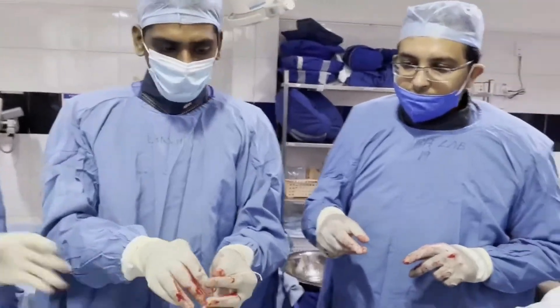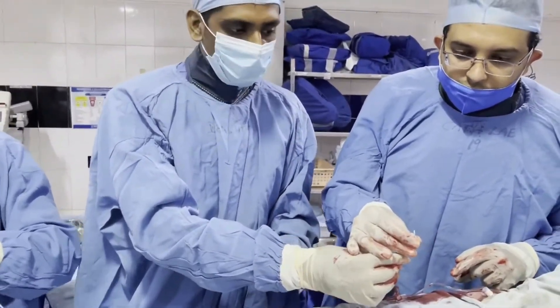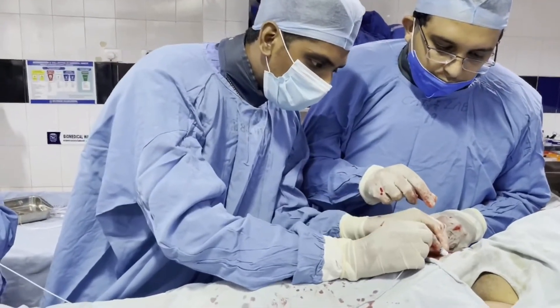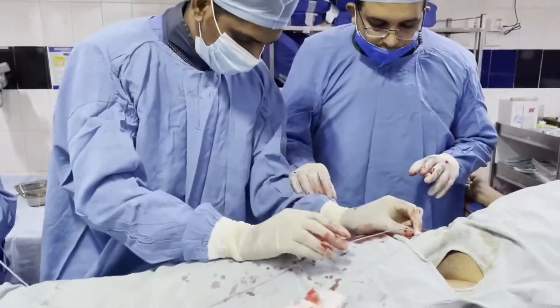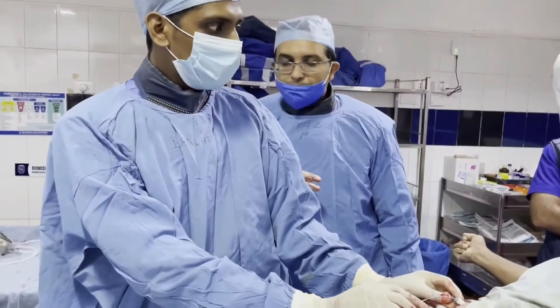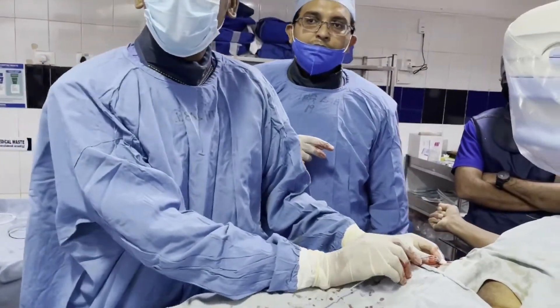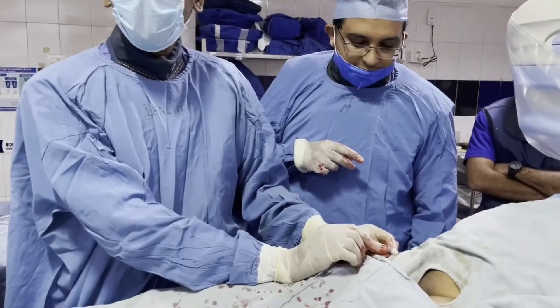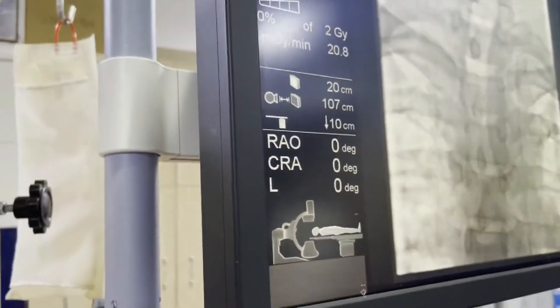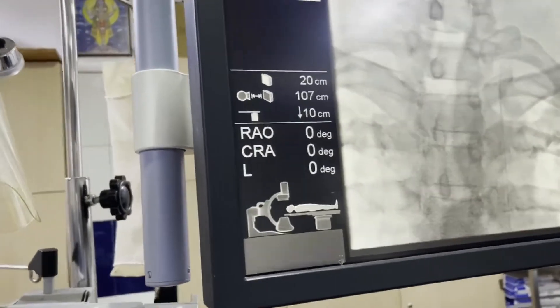Various catheters can be used — Headhunter, Glidecath, Vertebral, or even a Judkins Right catheter — based on patient age, estimated artery caliber, and expected artery response. Before inserting, make sure a wire is placed inside the catheter, as the wire should always be in front of the catheter by at least 10 centimeters. We have now inserted the catheter with the wire inside, and looking at the monitor, we can see the wire has reached up to the arch of aorta.